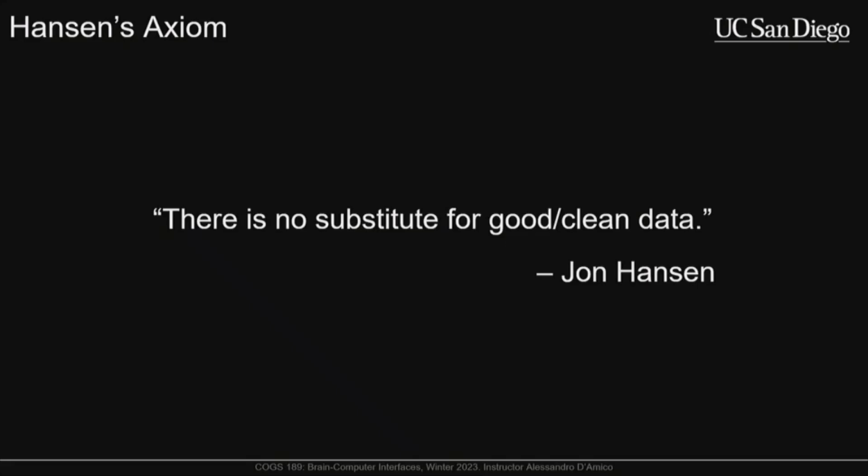So what could this mean for EEG? It could mean that you have poor connectivity between the electrodes and the subject's scalp, right? So we'll see this with dry electrodes where they don't have as good of connectivity to the scalp because they're pushed up on top of the hair. They don't have this conductive medium of gel that's bridging the tip of that electrode to the scalp. And so because of that, our signal quality tends to be a lot worse than these gelled or wet electrodes. Now, you can apply some filters to these data and extract some meaningful signals, but at the base, the overall truth is that those dry electrode recordings are always going to be worse than the equivalent wet electrode recording, and there's no amount of magic filtering or processing you can do to change that. You just have to deal with the fact that this is as good as the data can get after you apply your filtering or cleaning steps.